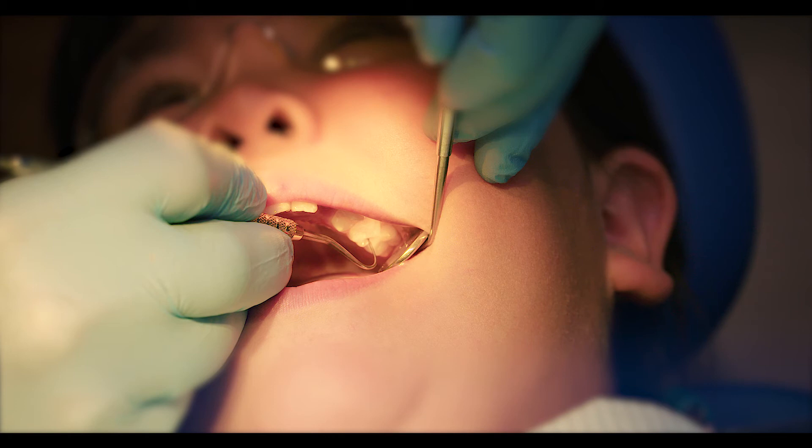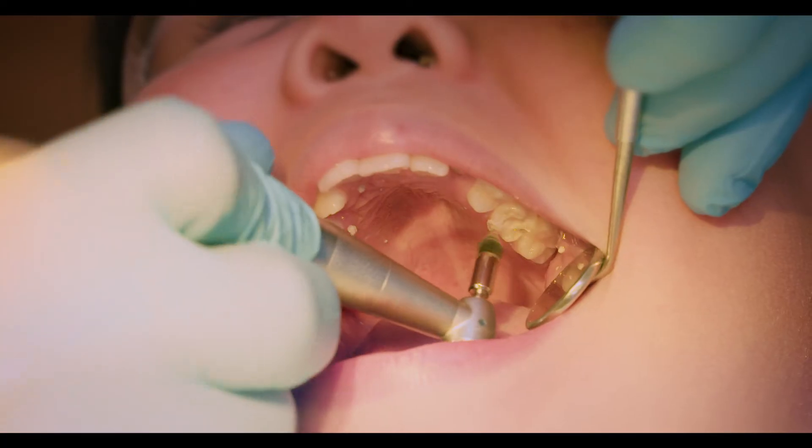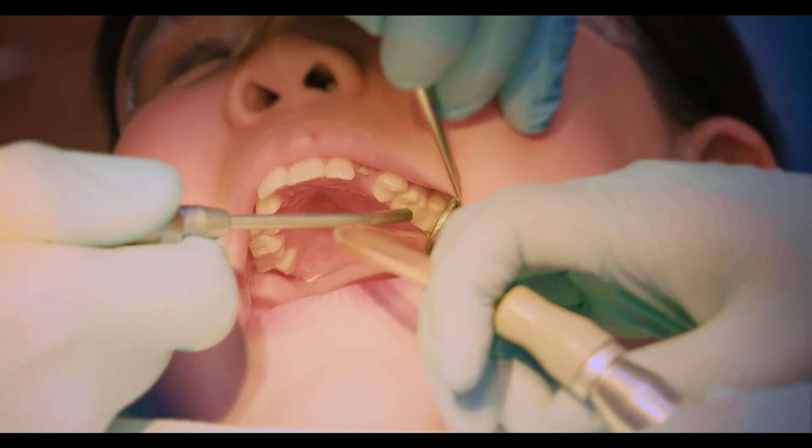This tooth has a cavity and will need a permanent filling. The tooth is first cleaned. A white paste is applied on the tooth for 15 seconds. The tooth is then washed and dried.